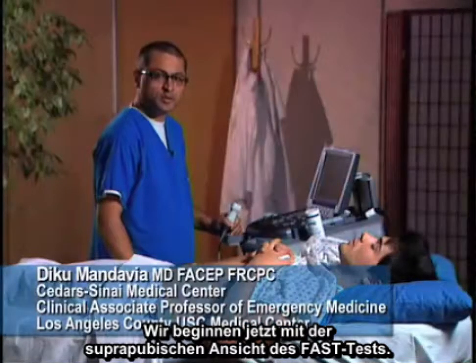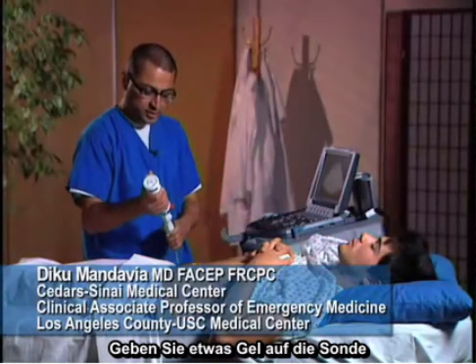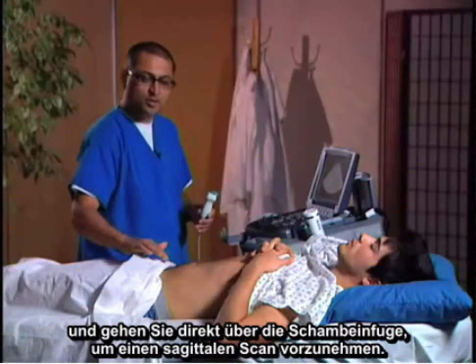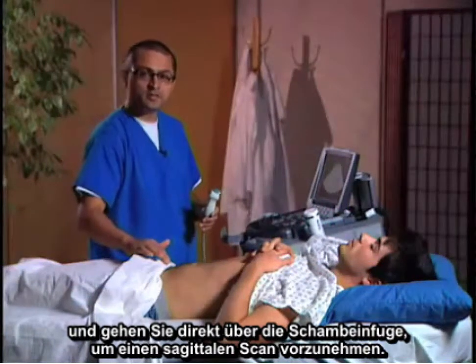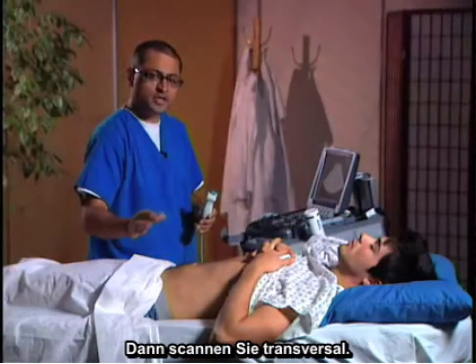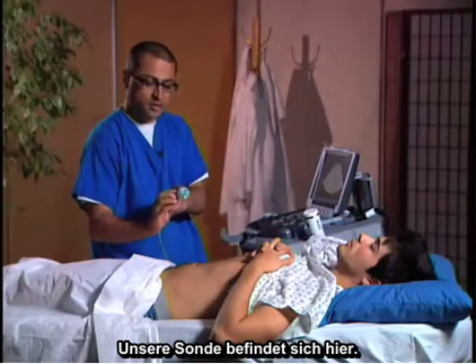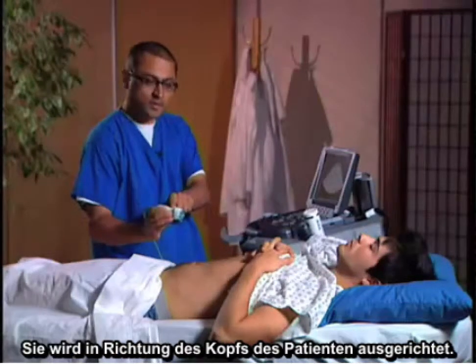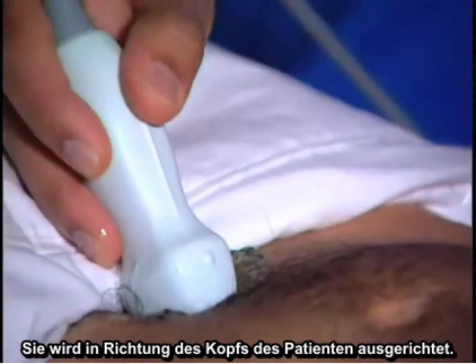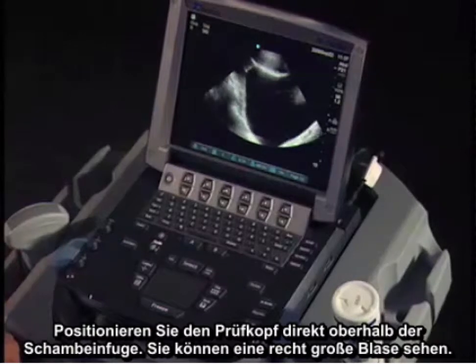We're going to go ahead and do the suprapubic view of the FAST exam. We're going to put a little gel on this transducer, and we're going to go just above the symphysis pubis. We're going to start initially sagittally, and then scan transversely. Our marker is aiming toward the patient's head, and we're going to put the transducer just above the symphysis pubis to see the bladder.